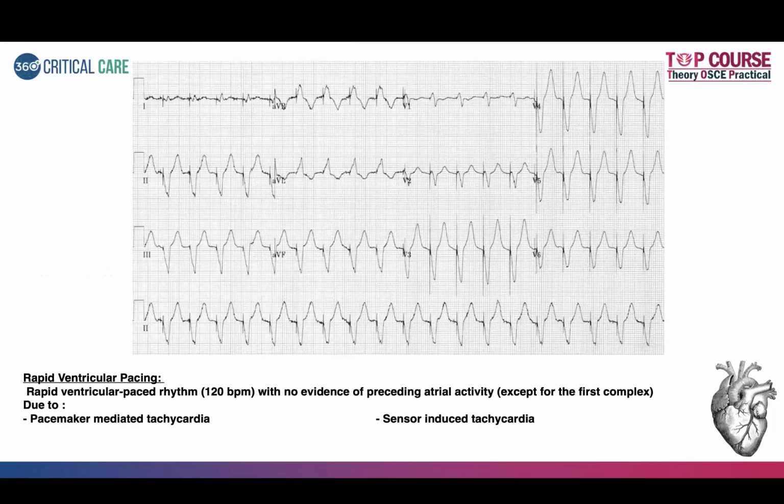Now there can be rapid ventricular pacing also. So there are two common etiologies. One is pacemaker mediated tachycardias and the other is sensor induced tachycardias. Now, in relation to both of these, they say that the initial generation of pacemakers that were used actually had a high predisposition to cause these problems. But with the current pacemakers, the risk of complications related to this is very less.